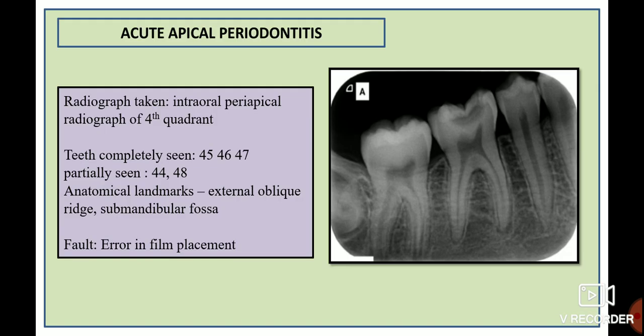Now let's discuss the second intraoral periapical radiograph, which shows a case of acute apical periodontitis. The teeth completely seen are 45, 46, and 47, and partially seen are 44 and 48. The anatomical landmarks present are the external oblique ridge and submandibular fossa. The radiographic fault is an error in film placement, because the occlusal plane appears oblique when it should have been horizontal.